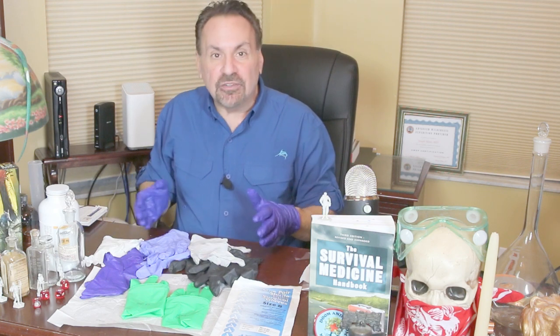Latex gloves are made of natural rubber and are thought to have the highest level of comfort and flexibility. They provide good defense against bacteria and viruses, and many surgeons prefer them because of their sensitivity.